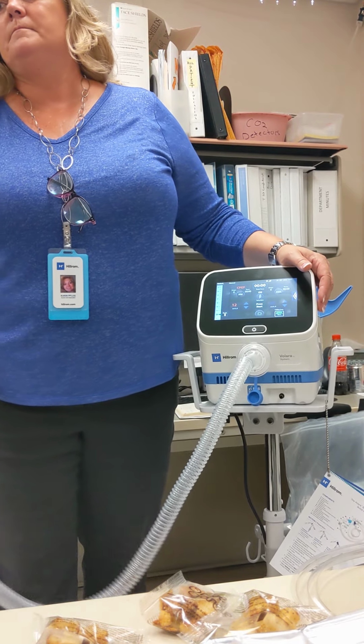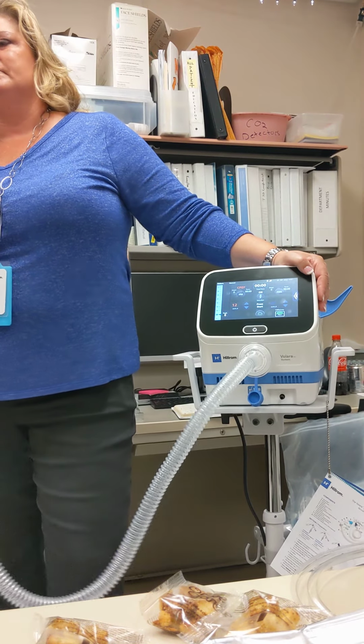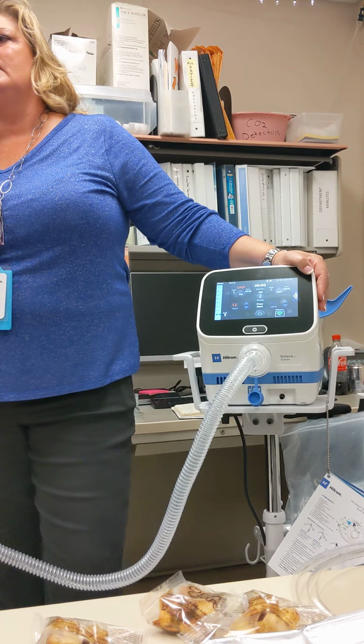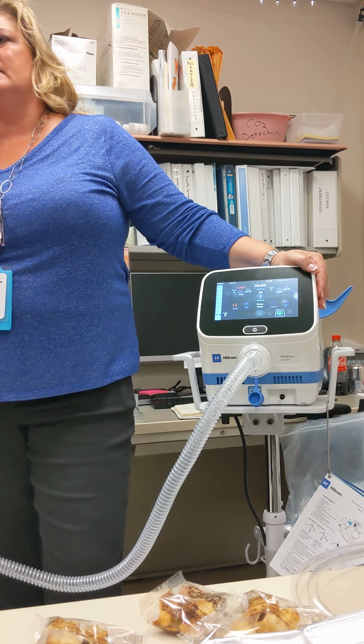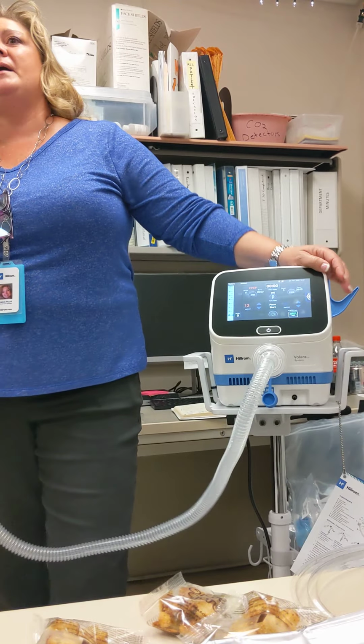Well, and it'd be nice to prevent escalation. Absolutely. And that's a huge thing. What's happening is we can't get it out, their mucus plugging, now they have to go to ICU, now we're going to bronch, now we're going to do all this, where we could have at least started something. Yeah. And we go back to the technique.